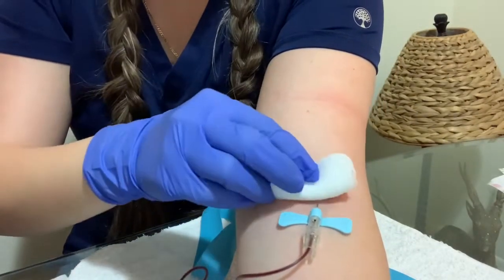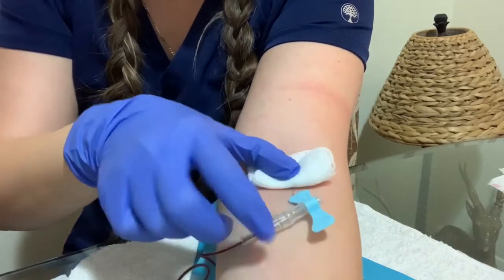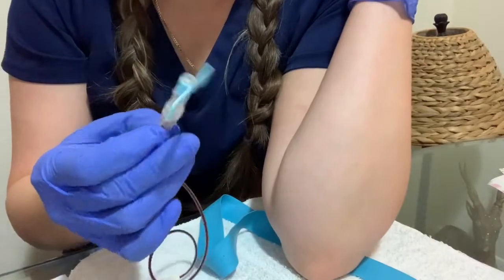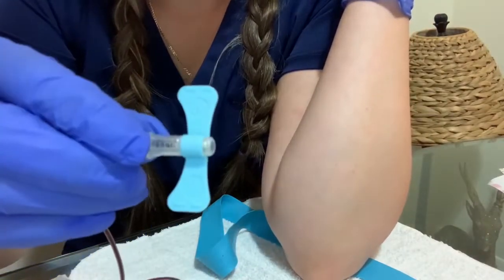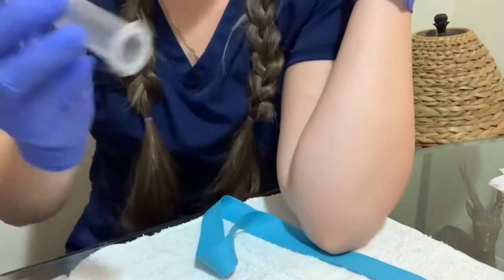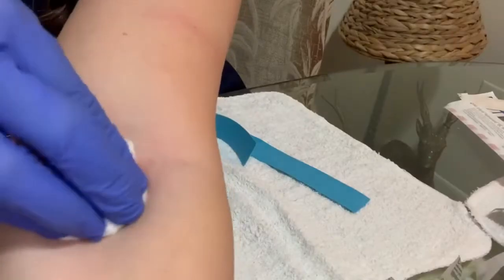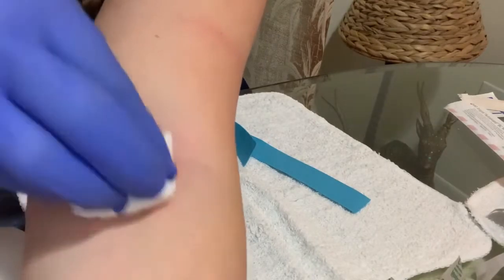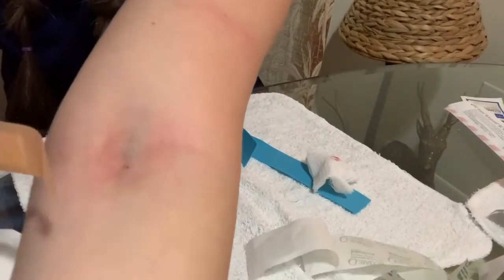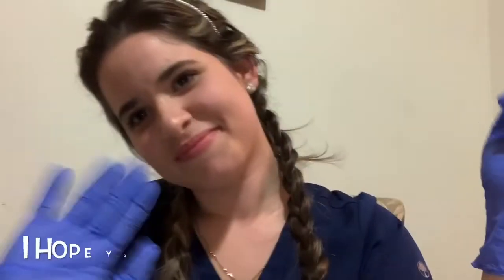Release the tourniquet and get the gauze, put pressure. These butterfly needles have a safety pin that you can just press and then it will retract safely.